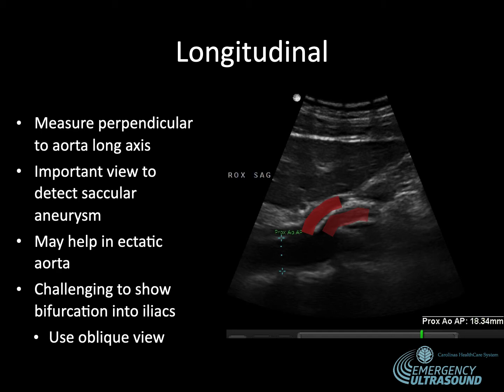It's a challenge to show the bifurcation into the iliacs on the longitudinal aspect, but make sure that you're scanning down to the bifurcation in the long axis. You can use an oblique view in order to visualize your iliac vessels.